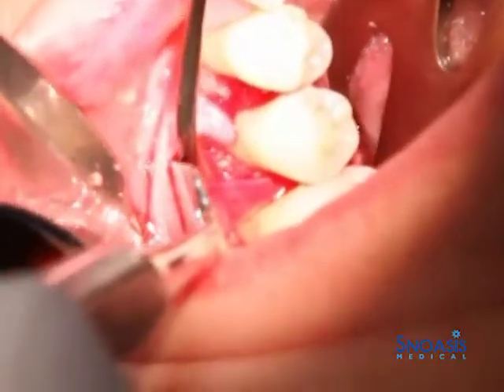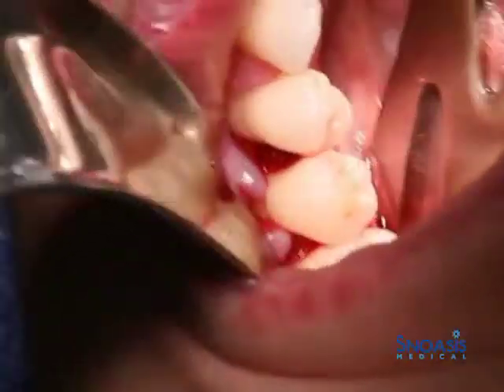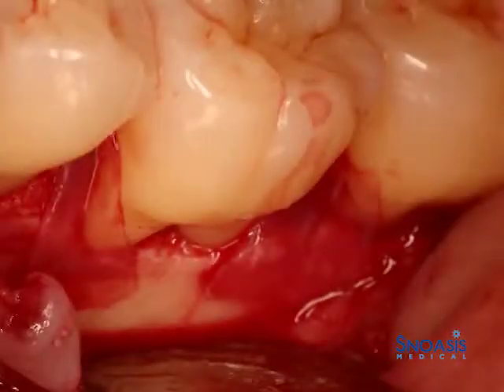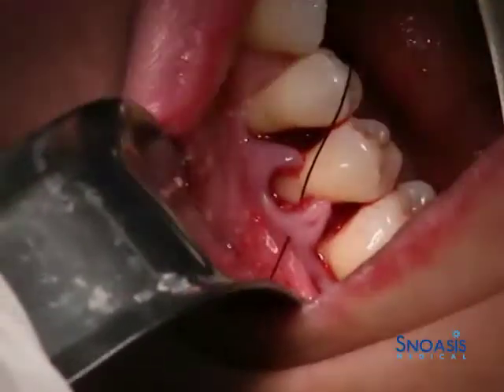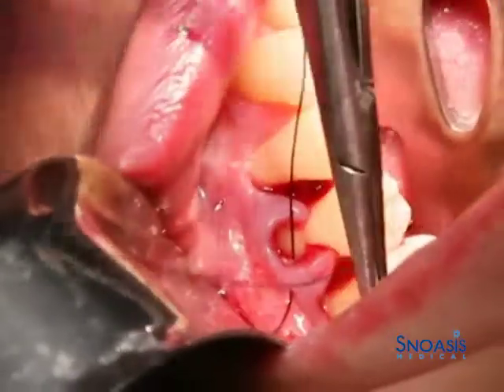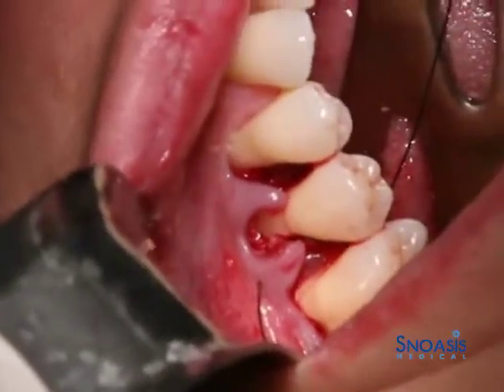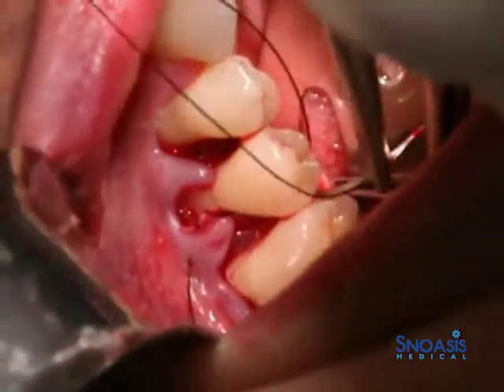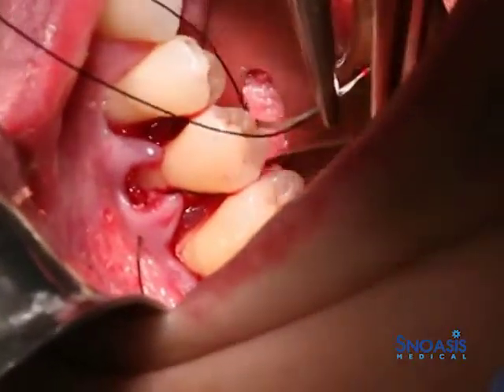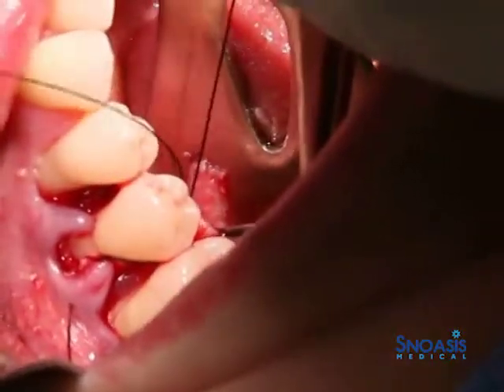We've got one barrier here, one barrier here. You can see them hydrating and we're ready to suture. The one thing you've got to be careful with when suturing is not to pick up the membrane. The easiest way to do that is go through backwards, and use corn forceps to manipulate your flap. The nice thing with the BioExclude is if you do have any exposure during healing, like in the col area, it's okay because it can become exposed and heal just fine.